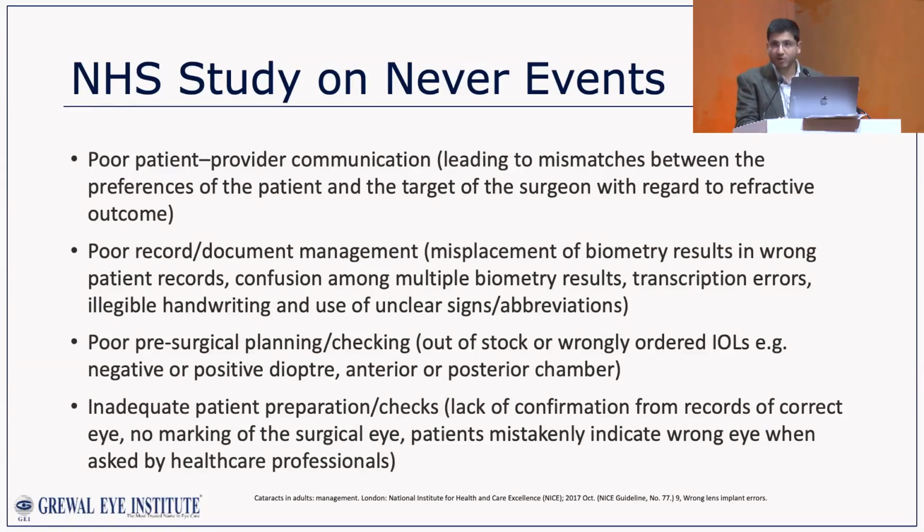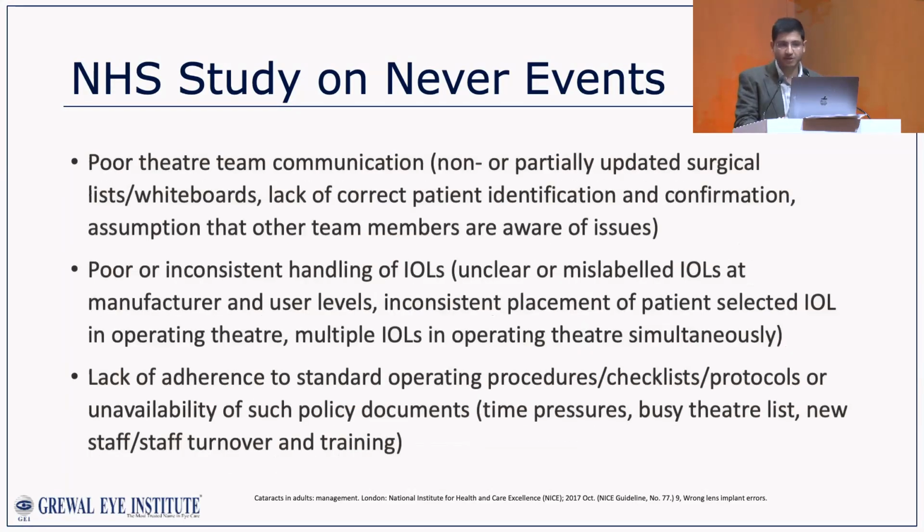The other important thing, other than just efficiency, is also outcomes. There are certain never events, errors that happen because of transcription errors in entering data at different points. And using digital technology like this, again, NICE in the UK showed that we can really reduce the occurrence of such never events. It's usually the communication handover from one point to the other where you can have errors. And if you can reduce this with such technology, it really helps.